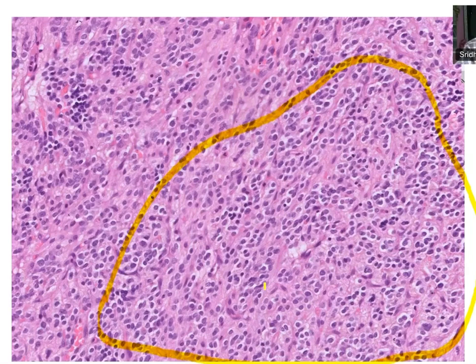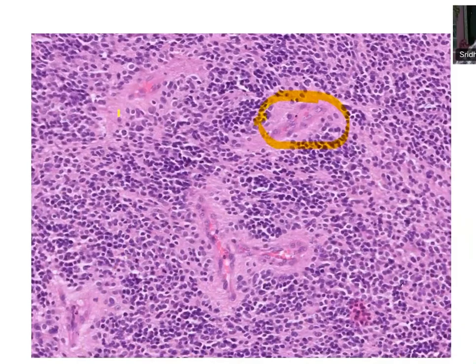So you're looking at a supratentorial located high-grade tumor. What does this morphology, these areas you highlighted, show? Fibrillary processes of the tumor around the vessel. What does it tell you? Pseudo-rosette formation, like perivascular ependymal-like rosettes. Okay.